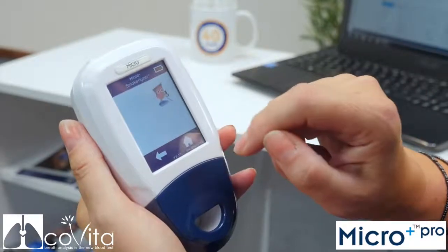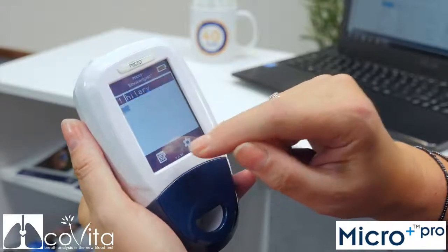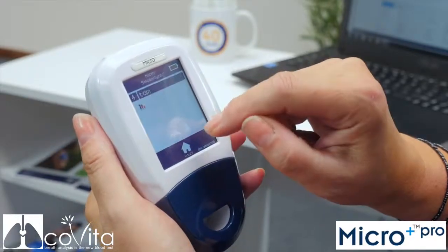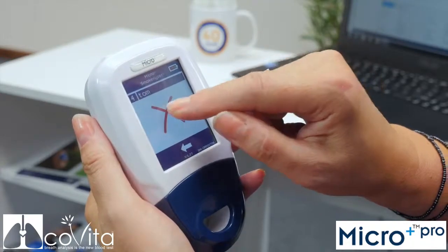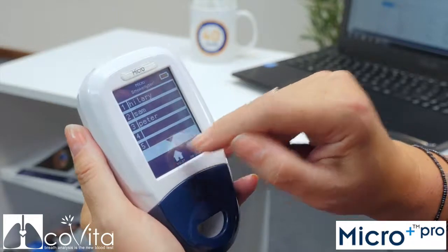To delete a patient, simply click the X whilst on their patient profile and click X again to confirm. Click Home to return to the main screen.